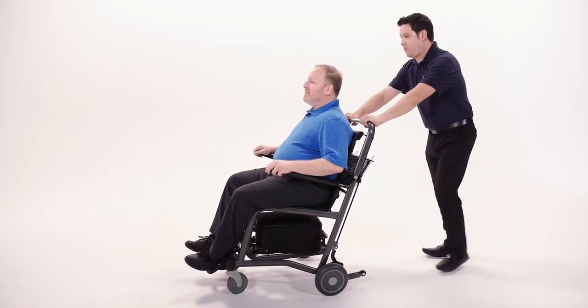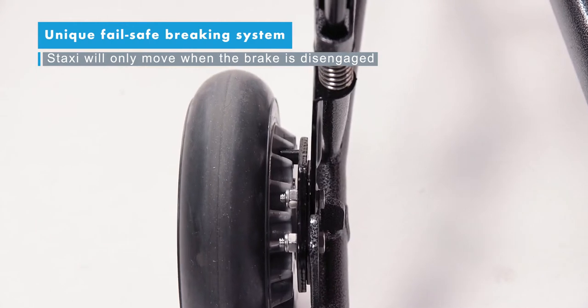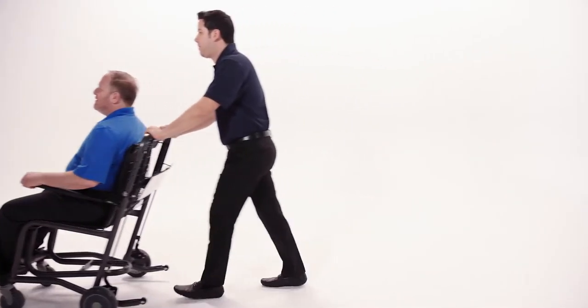The Staxi Ranger features the revolutionary and unique fail-safe braking system. The chair will only move when the brake is disengaged by the attendant, making it inherently safe and eliminating brake failure or failure to deploy. Now that's safe and secure.